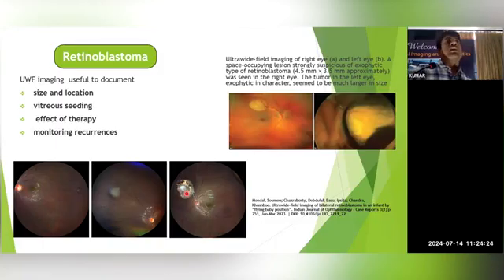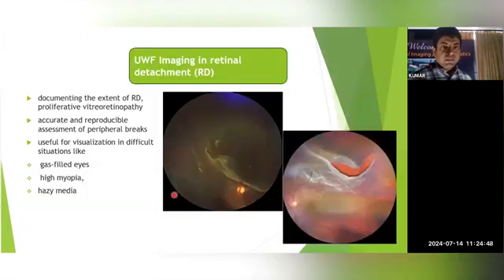And it also helps the medical oncology physicians to get a proper diagnosis and plan the management. Also, during follow-up, we can see how much the lesion has reduced in size. Vitreous seedings can be easily picked up. Subretinal fluid is important in the classification, so how far is it from the lesion? All those measurements can be easily done in wide field imaging.